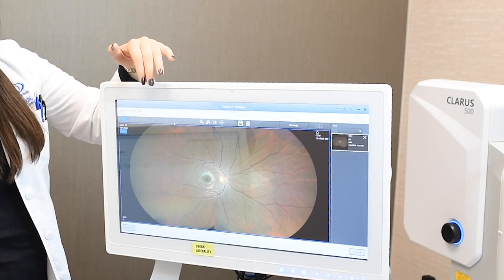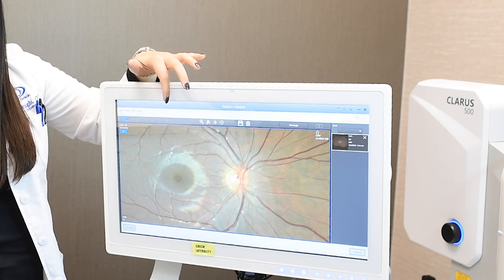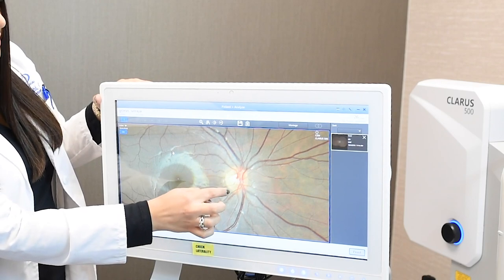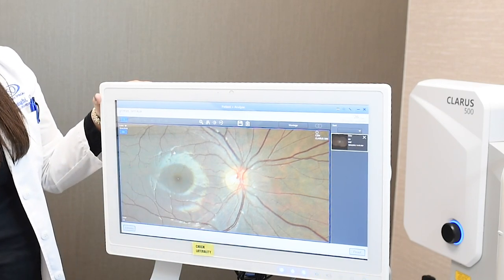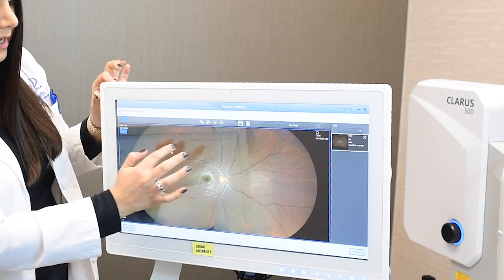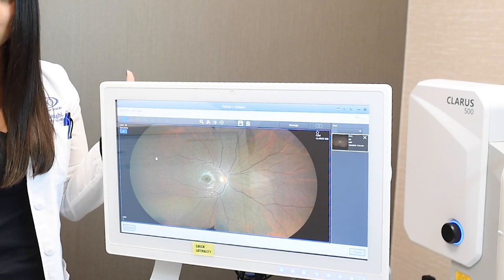It allows us to look at the retina. We get to zoom in. We get to look at the structures that are very important to look at every single year. We zoom in here, make sure these aren't changing, blood vessels look good, the macula looks good, and then we get to zoom out and look all in the periphery and the sides, make sure there are no holes, tears, any bleeding, anything unusual.